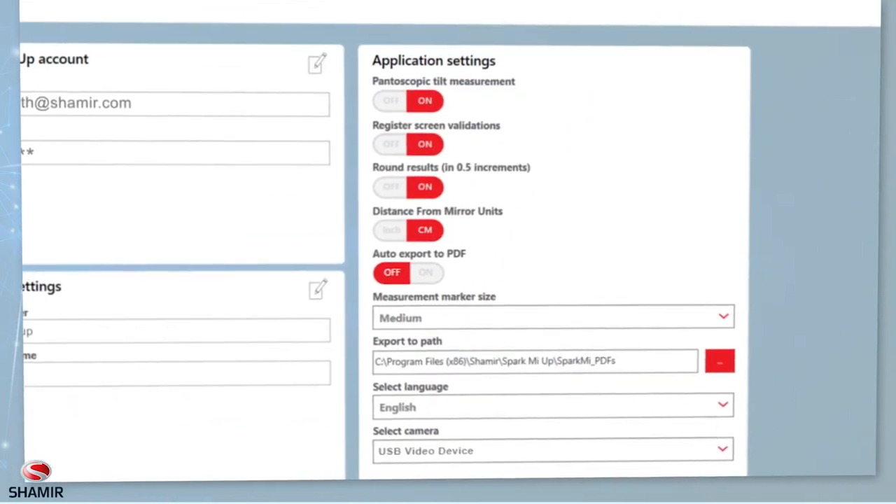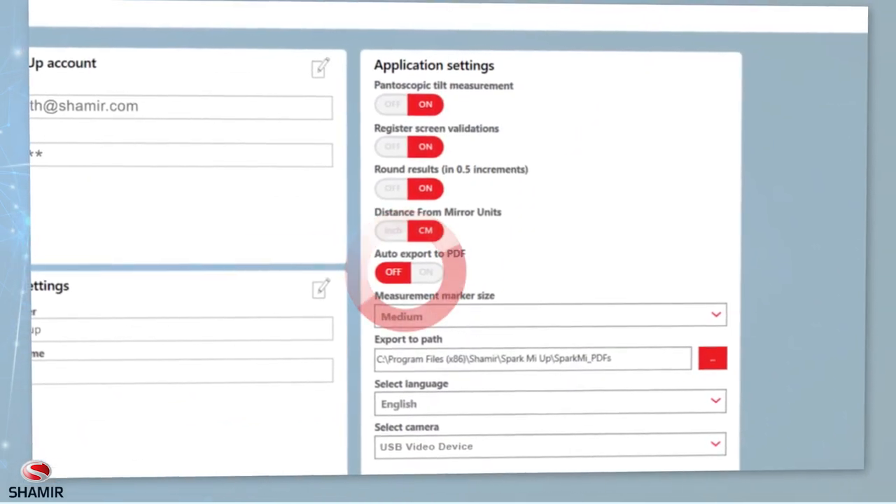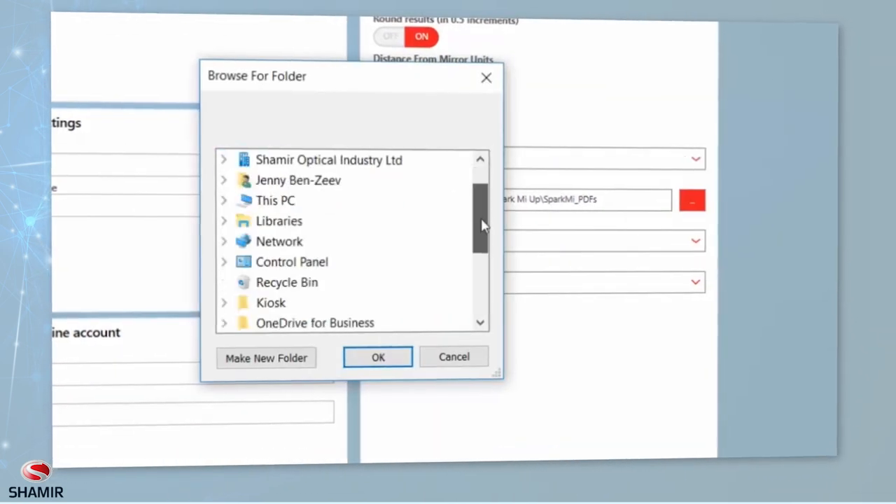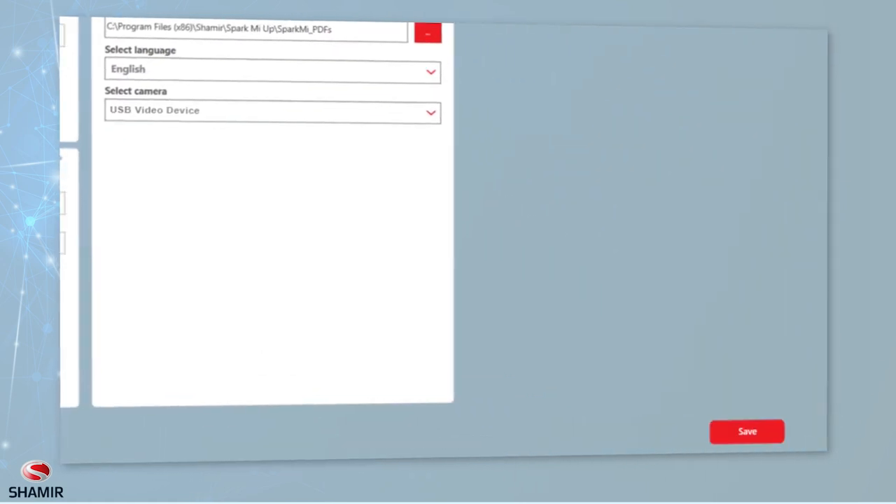To automatically save your patient's measurements as a PDF file, click the On-Off button and choose the directory where you'd like to save the PDF files. Then click Save.